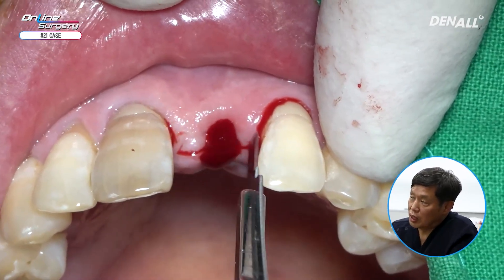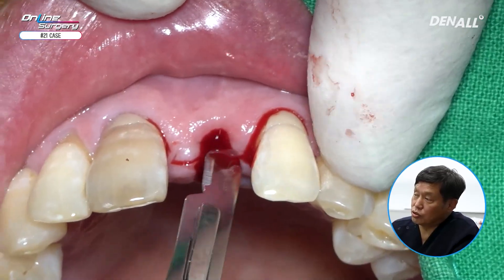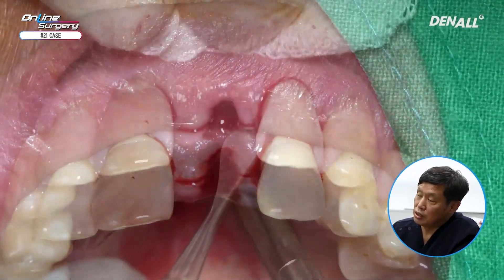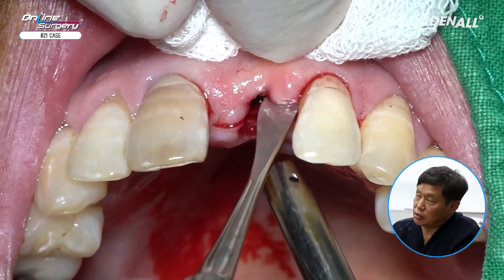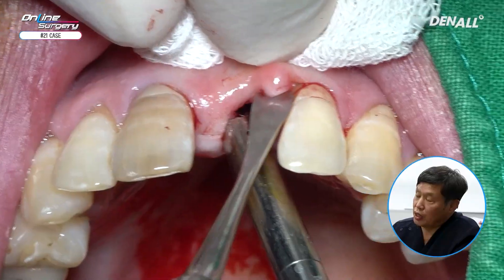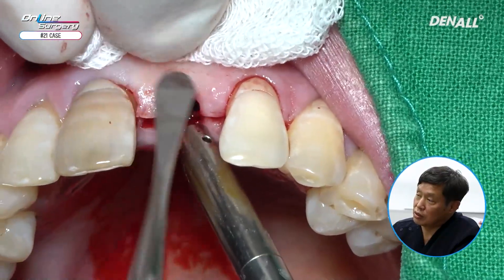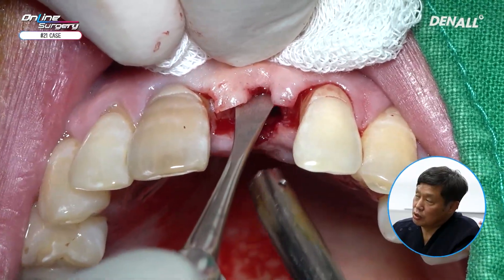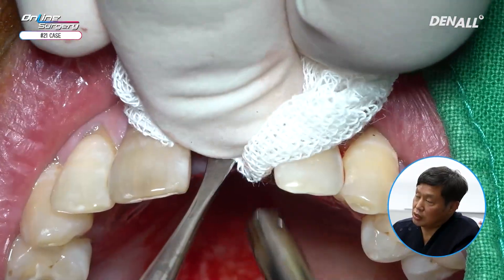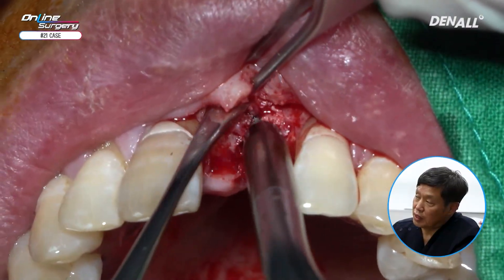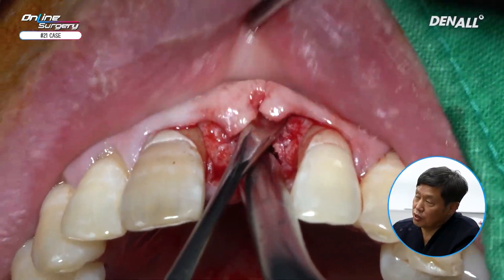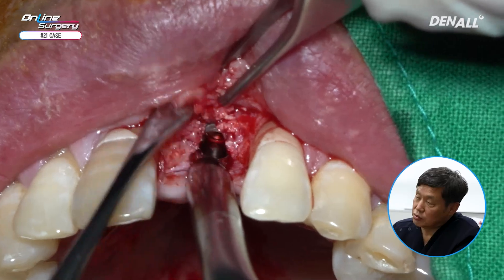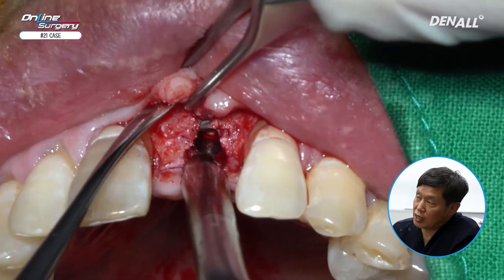In order to prevent soft tissue shrinkage, we carefully created a flap on the labial side and performed a sufficient bone graft to preserve the anterior bone. As you can see here with the flap open, the implant surface is slightly exposed on the labial side in the socket preservation area.